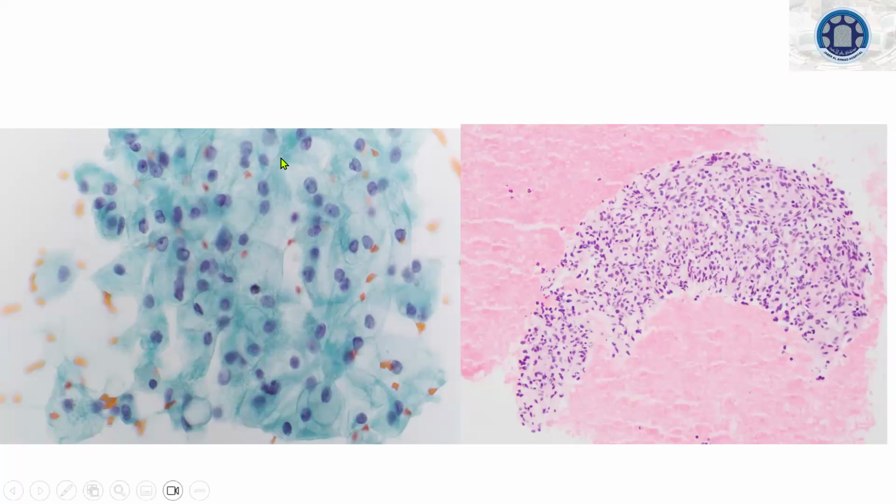Now, if you can try on your own to describe this cytology, then you will get the diagnosis. How will you describe each cell? And then you have your diagnosis. What is the cytoplasm like here? How will you describe the cytoplasm? And how will you describe the nucleus? Cytoplasm is clear, right? And this is central nucleus. And this is the cell block. Suppose it's not pancreas, it's from anywhere. Suppose it's from the liver. What will your first DD be? Or if it is from a skin nodule? Or is it from brain?